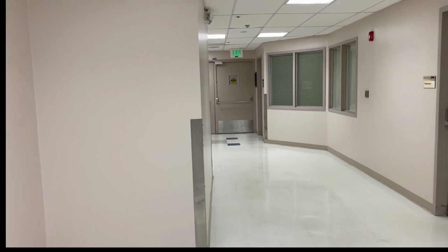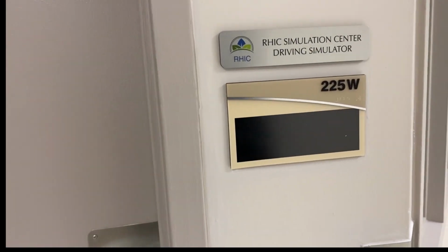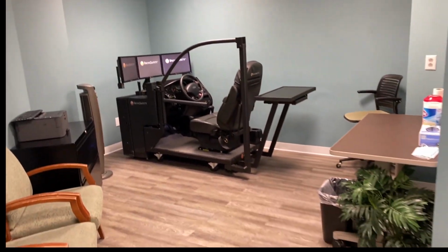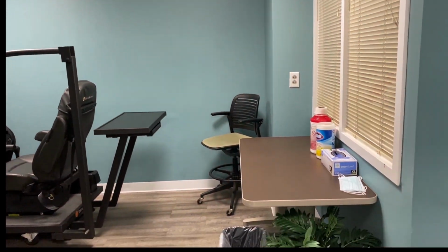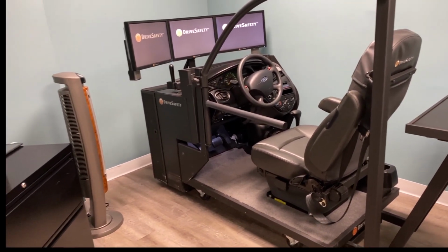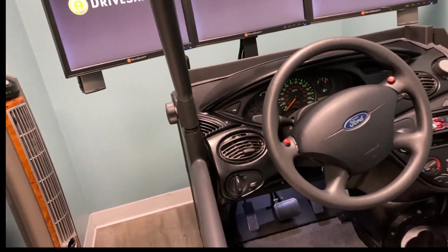And then finally we'll go to the front right of the Sim Center acute care area, and this is the driving simulator room. Occupational therapy students from Indiana State University use this frequently, at least once or twice a week. They practice skills with each other, and they also bring down patients from the hospital's medical rehab unit to train them or assess them for being able to drive after a stroke. These patients come down here and get evaluated by occupational therapists that are trained in the use of the driving simulator.